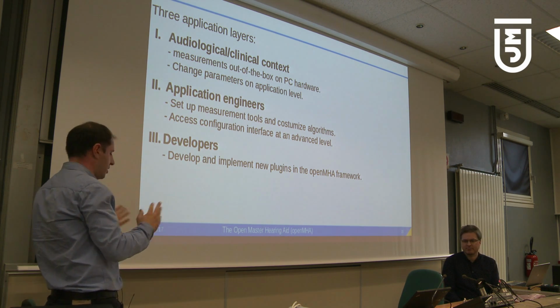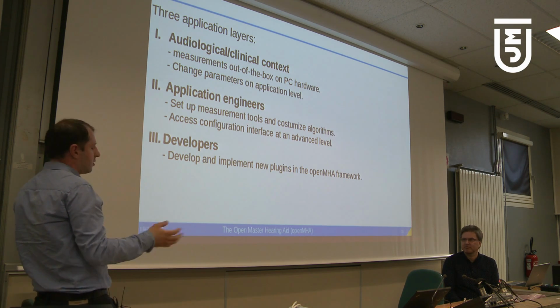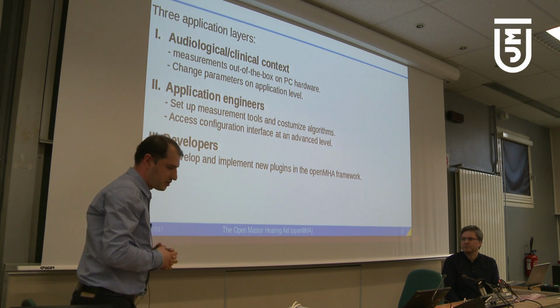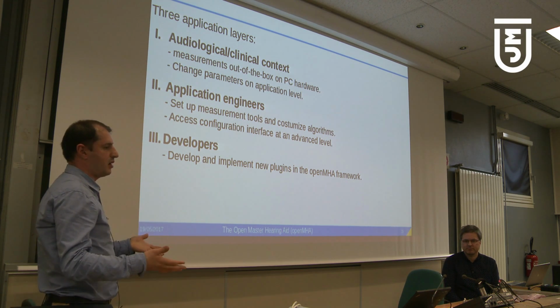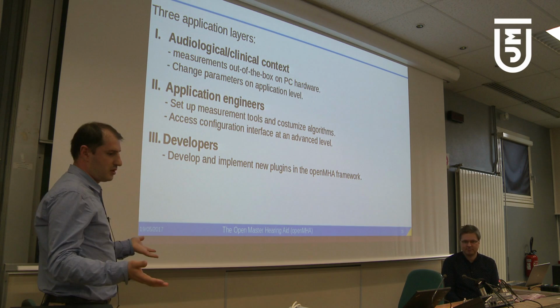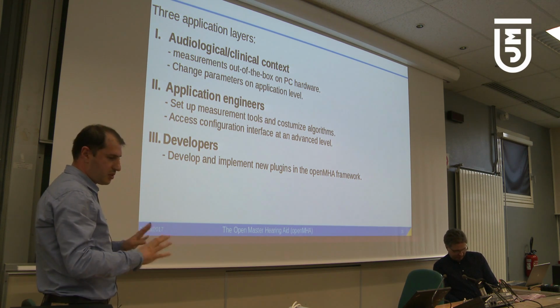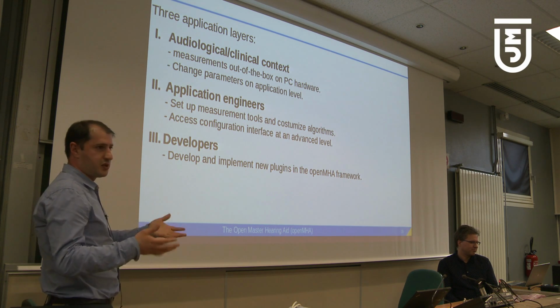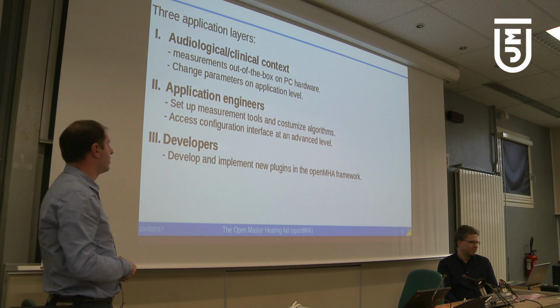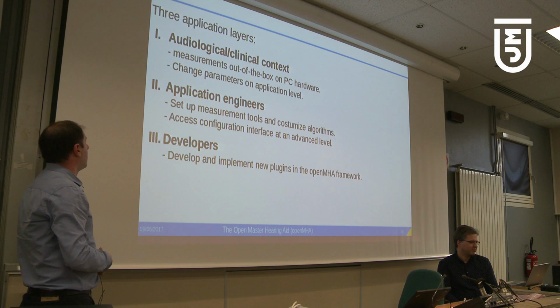The first is the audiological and clinical context, where one should be able to make out-of-the-box measurements on a PC, general purpose hardware, and change the parameters on an application level.